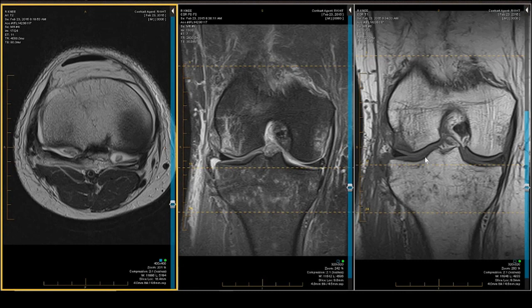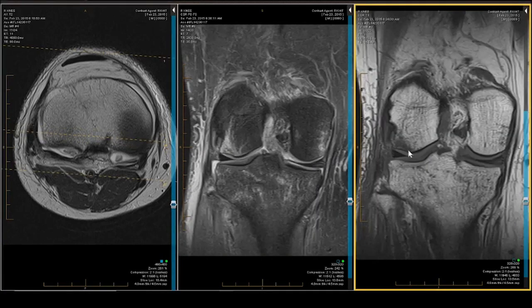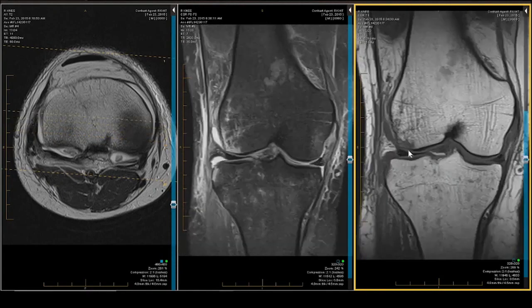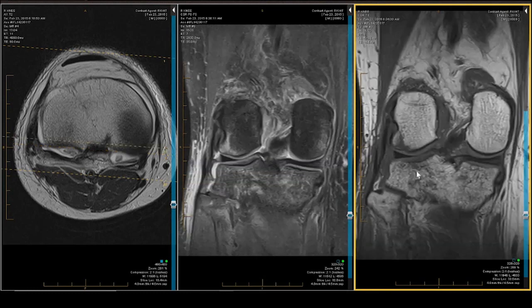Let's look at the coronal T1, because that's where you'll get your best depiction of the fractures. There is a depressed fracture in the femoral terminal sulcus, and there are paired posteromedial and posterolateral fractures. This patient has had a component of a pivot shift — remember, he reported a twist.